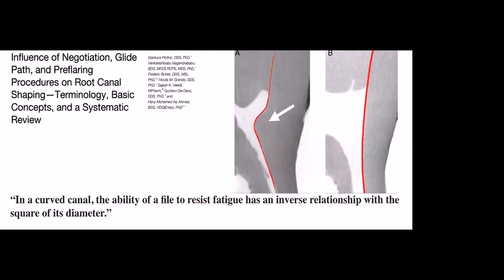If we don't eliminate this coronal interference in the entry of the orifice, the file is going to bend at that point. So if the file is bent at that point, it's going to suffer cyclic fatigue. So it's very important in those cases with coronal interferences, for example the root canals of the molars, to eliminate this coronal interference at the beginning of the preparation.